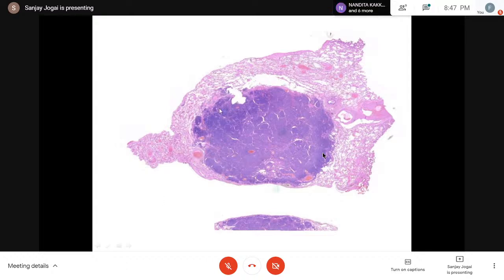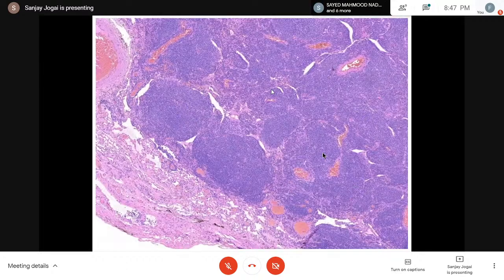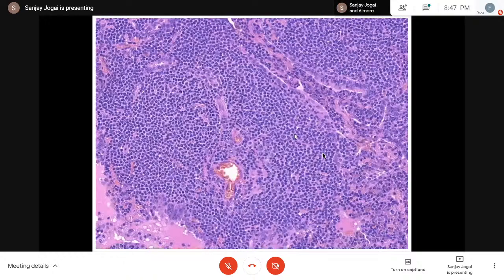So a beautiful section showing a relatively well-defined bluish lesion, clearly looks very lymphoid, background looks normal, and you can imagine that imaging-wise this could easily be carcinoid. And nice lymphoid aggregates. And how do the lymphocytes look? So they are relatively monomorphic, very mild cytoplasmic clearing, and that's a nice area of lymphoepithelial lesion where you have the epithelium infiltrated by lymphocytes.